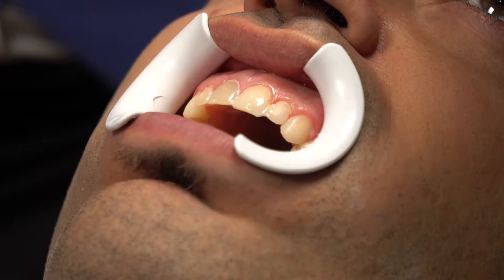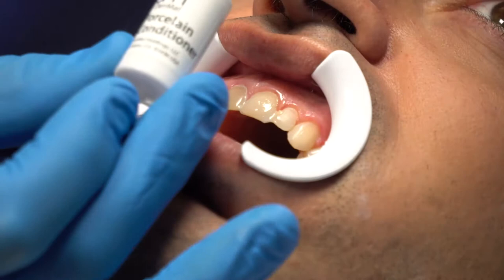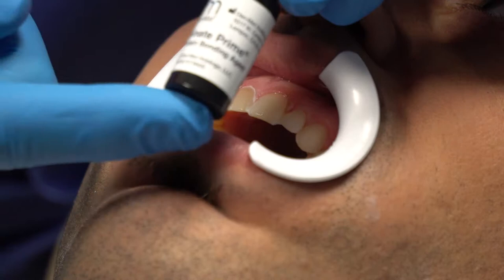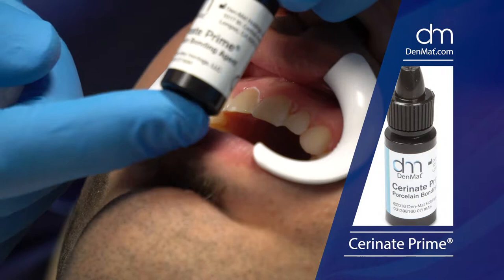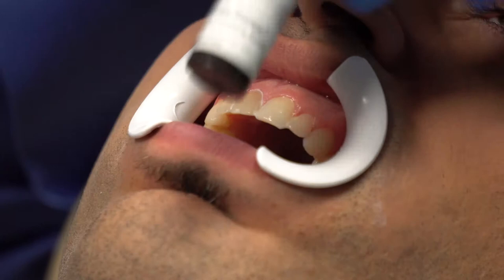Denmat's philosophy has always been to silanate first, try it in, then clean it out with resin — because you can't contaminate resin with resin. The silanization process: the porcelain has been etched already. This conditioner is citric acid. Rinse and dry after 30 seconds. You should get a frosted white appearance because it's already been pre-etched. The Cerinate Prime is a silane — not pre-hydrolyzed, so it requires acidification of the surface first, then Cerinate Prime.